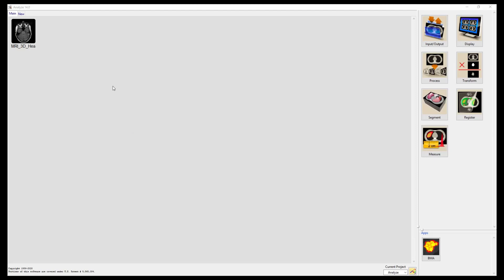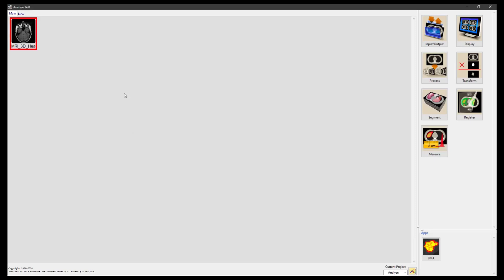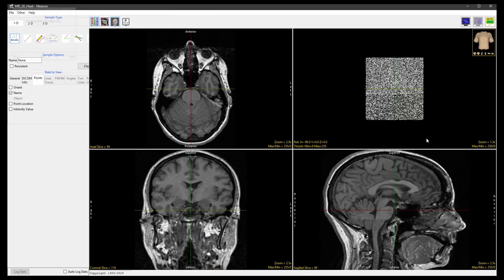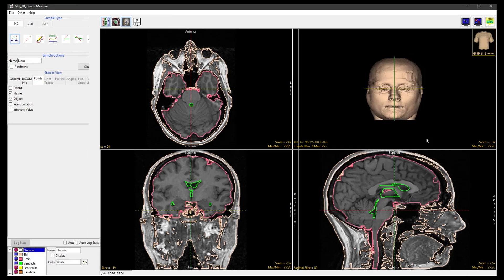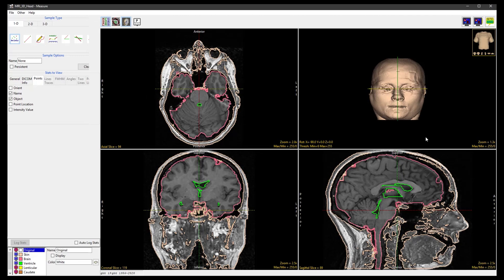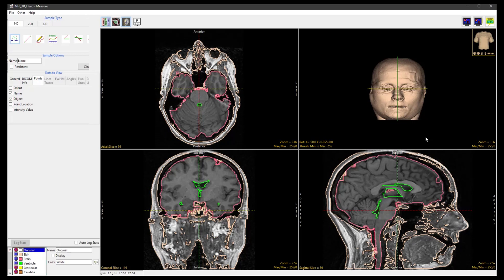To start, select the dataset and open Measure. An object map must be loaded for this sampling option to be available, and for this dataset, we have previously set it to automatically load. A number of objects have been defined, and to see them all in the rendering window, we can right mouse click and select Transparency.